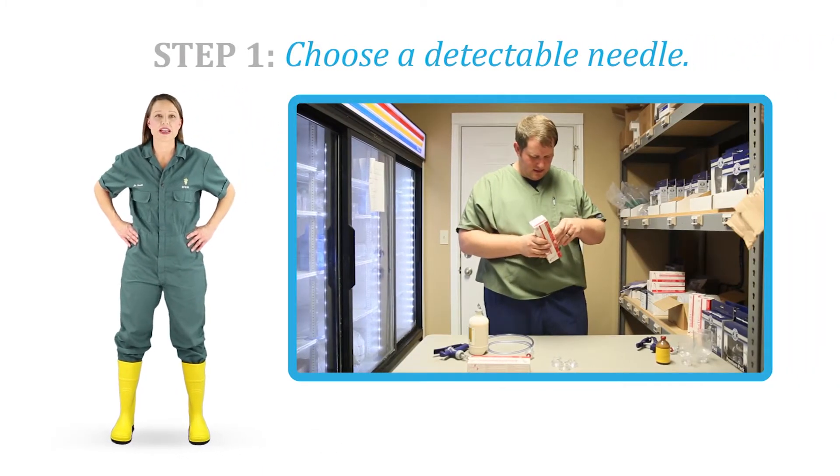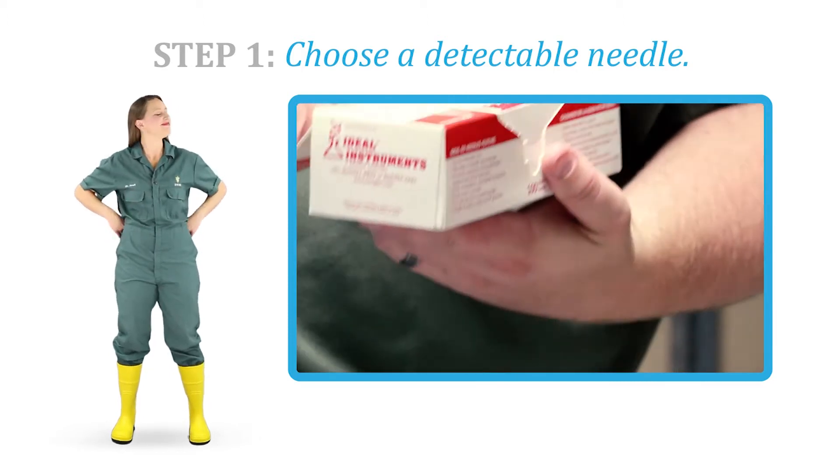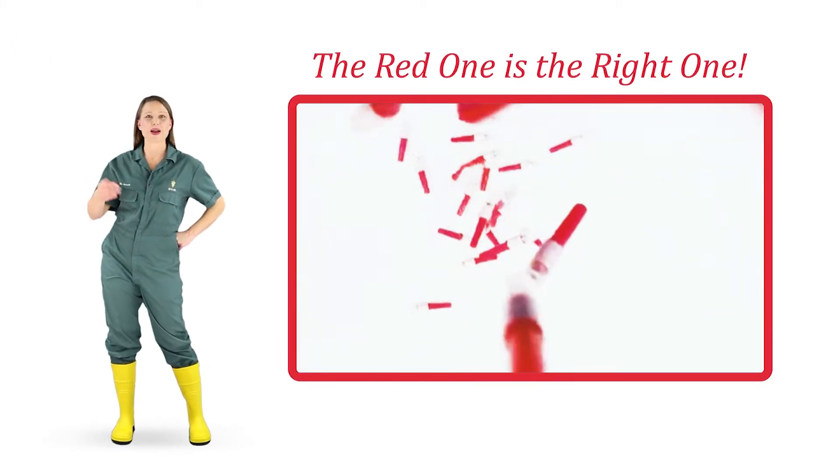Step 1. When treating or vaccinating, choose a detectable needle. You'll know it's a detectable needle if it's the right color. Detectable needles are red. The red one is the right one.